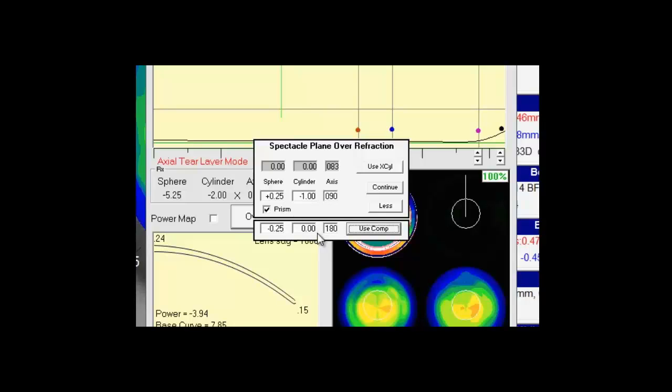It's also important to note that when we enter this over-refraction, I only clicked the use comp button once. If I click it multiple times, it will continue to add your over-refractions. So do not double click, only click that button one time, verify that the values are what you want, and then hit continue.